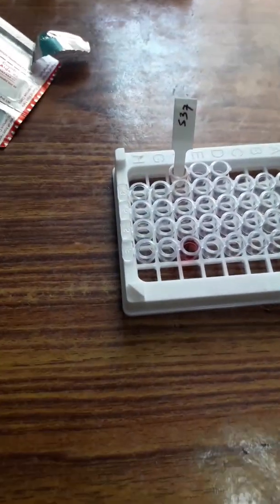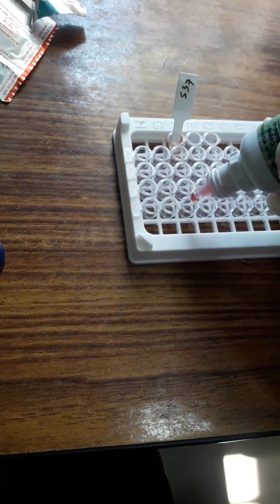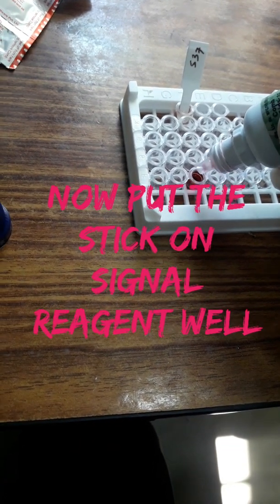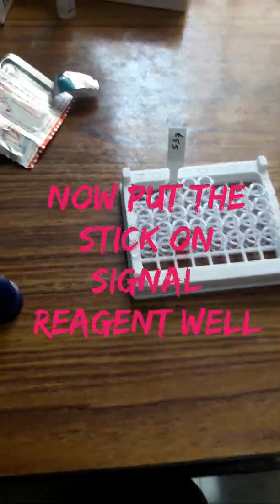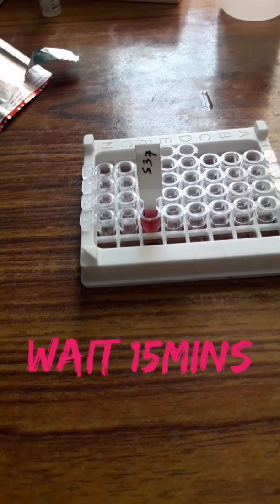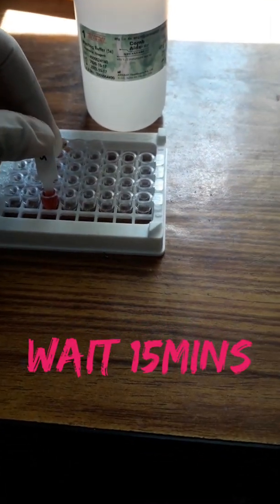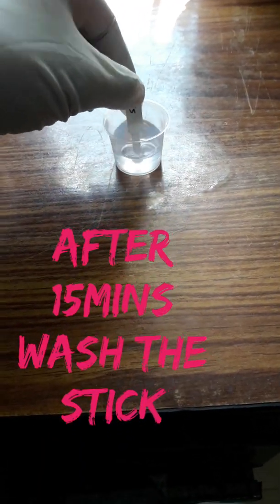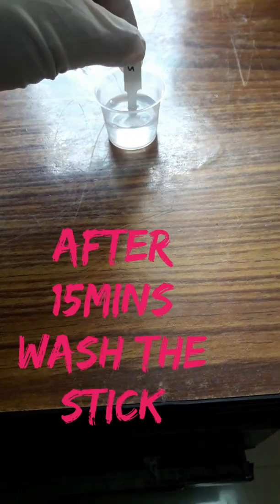Now put the signal reagent sample into another well separately, and fill the well properly with signal reagent. One important thing: in every laboratory procedure we must wear masks and gloves. Place the dry stick onto the signal reagent well and wait for 15 minutes. After 15 minutes, again wash the stick in wash buffer and keep it to dry.